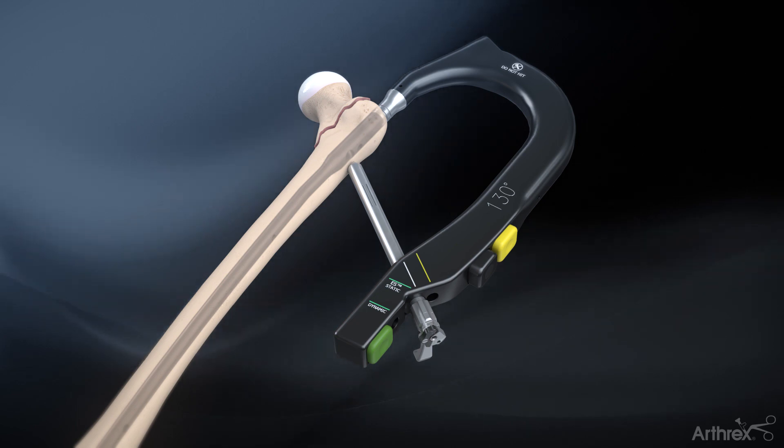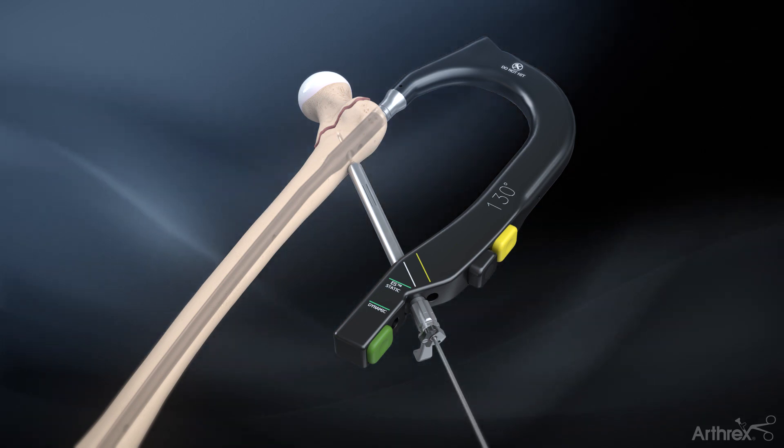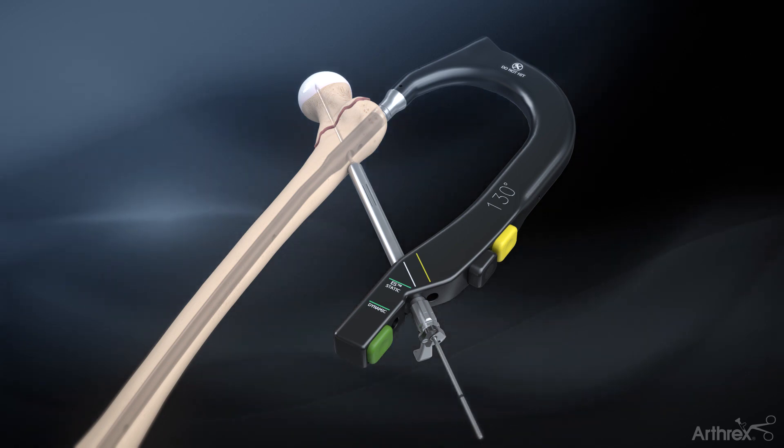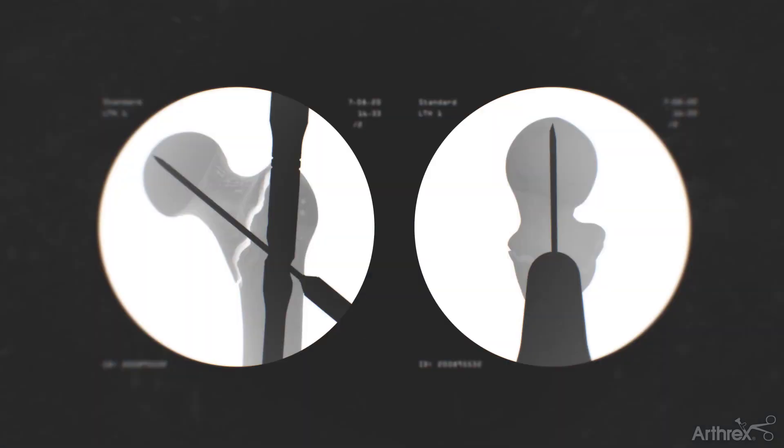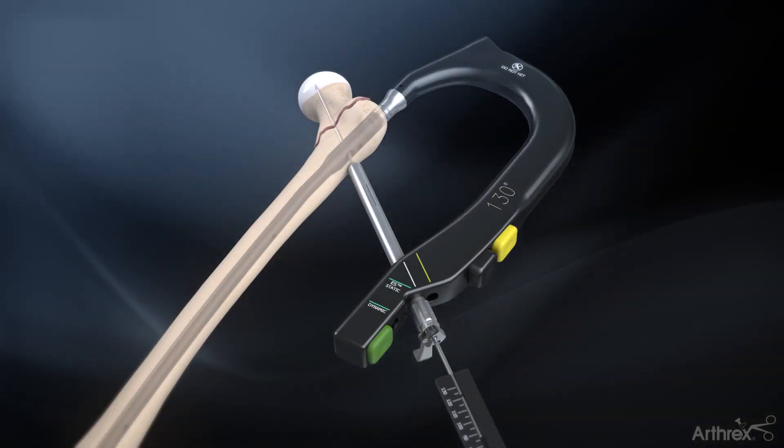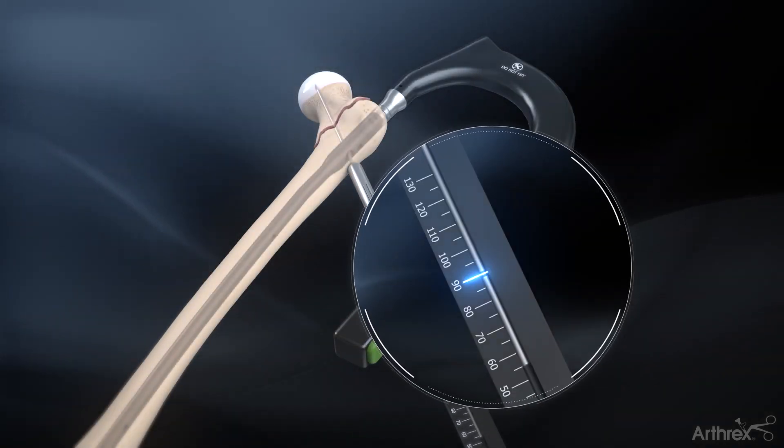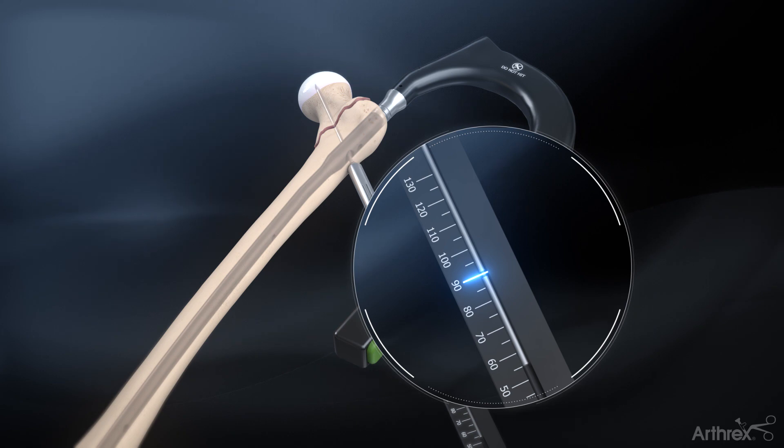Remove the obturator and place the 3.2 mm lag screw guide pin through the pin guide. Verify the pin depth and trajectory using fluoroscopy. Place the guide pin depth gauge with the flat end against the pin guide under the 3.2 mm lag screw guide pin and read the measurement.